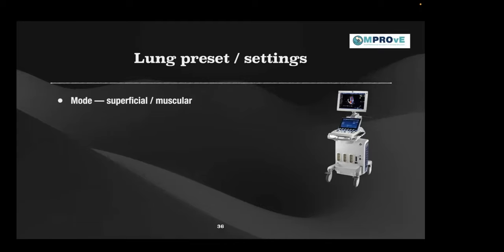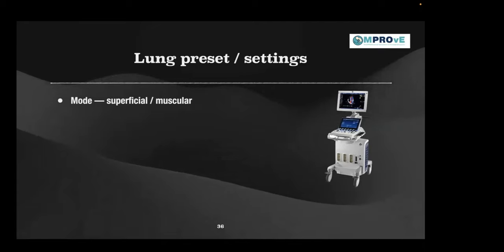The mode: we always use a superficial or a muscular mode, because we're going to use a high frequency probe and we are trying to look at a very superficial structure with very good clarity. So we always use a superficial, muscular or vascular mode. All these are superficial structures.